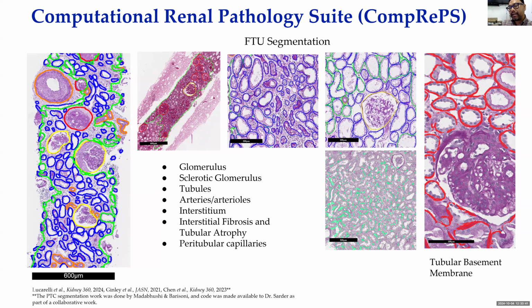And from the tissue segmentation, the moment we segment it, we can ask the computer to find out several pieces of information: how big the structure is, how many nuclei are there, what other information is there. You can imagine each dot here is a structure, and they have multidimensional features which we can project, and that may allow us to find trends. For example, you may not see a trend in the data from one angle, but from this angle it shows three. This is called understanding of the manifold. How that understanding of the manifold compares at the cell and cell-level is something we wanted to do.